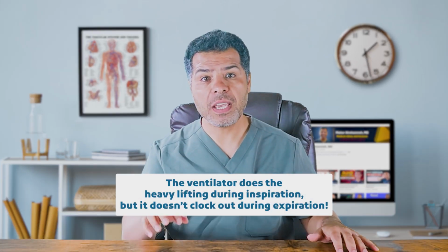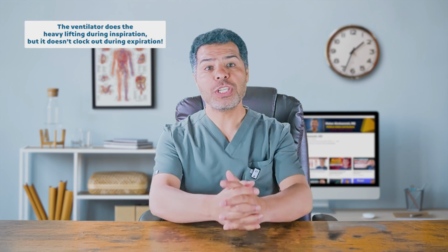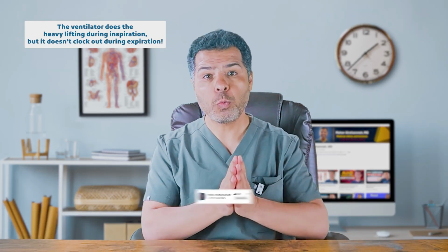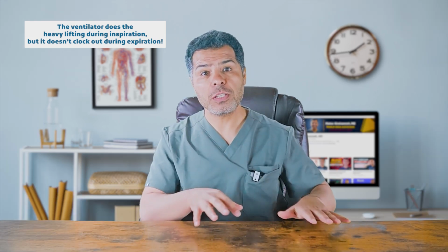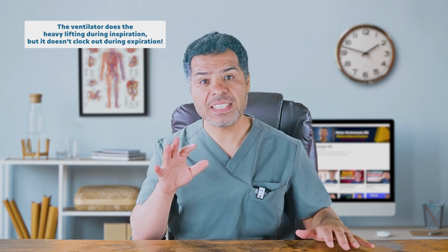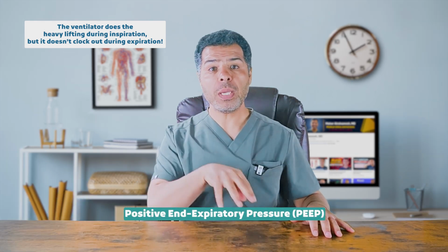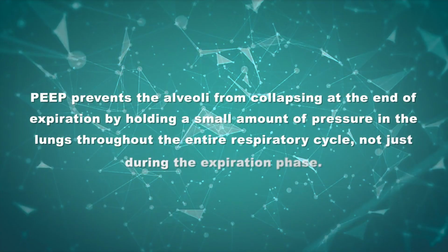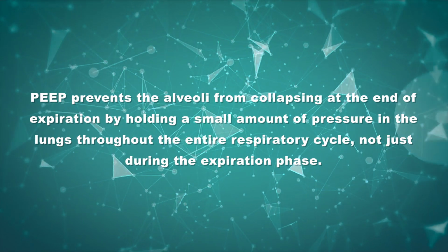The ventilator does the heavy lifting during inspiration, but it does not clock out during expiration. As we mentioned earlier, inspiration is an active process that requires energy, so the ventilator works mainly during this active, energy consuming phase. But that does not mean the ventilator just shuts off during expiration. It continues to play a crucial role by maintaining a certain level of pressure that is called PEEP, or positive end expiratory pressure. PEEP prevents the alveoli from collapsing at the end of expiration by holding a small amount of pressure in the lungs throughout the entire respiratory cycle, not just during expiration phase.